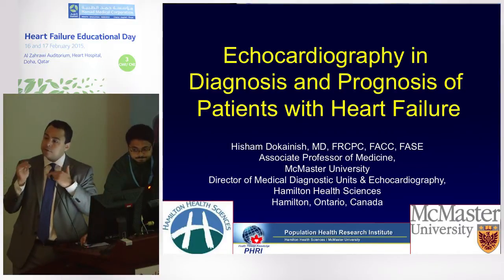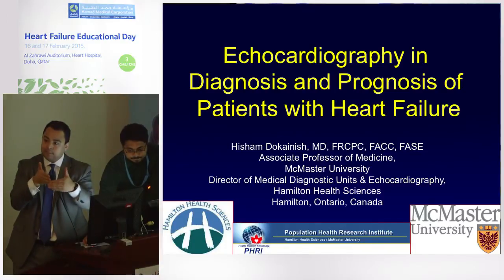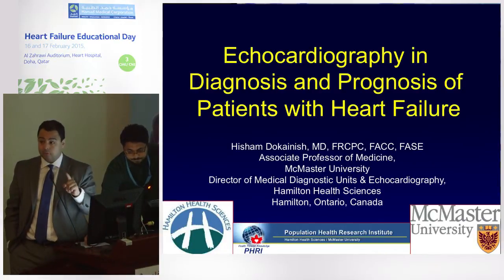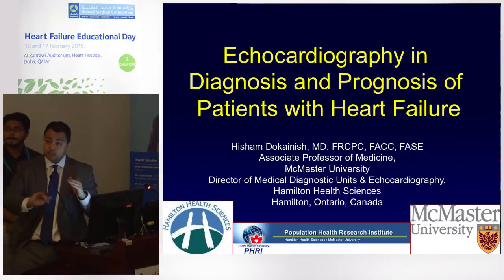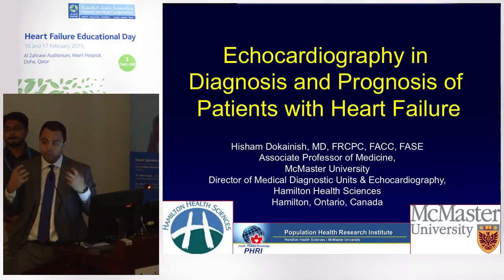So the answer to you is, if your instantaneous Doppler assessment is at the time that they have dyspnea, and they have grade 1 and the E wave is low, then it's highly unlikely that they're in heart failure. However, if I take that person to the Chinese buffet and we do 3 laps and we ingest 500 grams of sodium, and I chase that with a lot of water, that little old lady with a preserved EF and a small hypertrophied ventricle can easily switch to pseudonormal filling or even restrictive filling very quickly. It's dynamic, highly preload dependent, so you have to be aware of those issues.